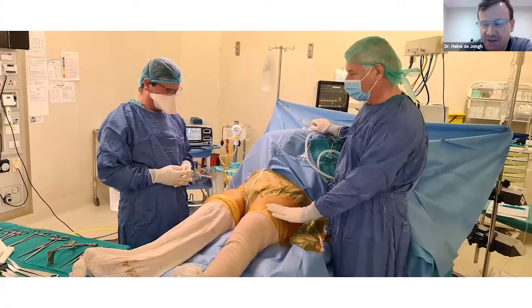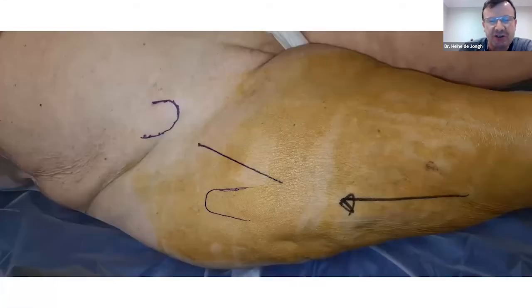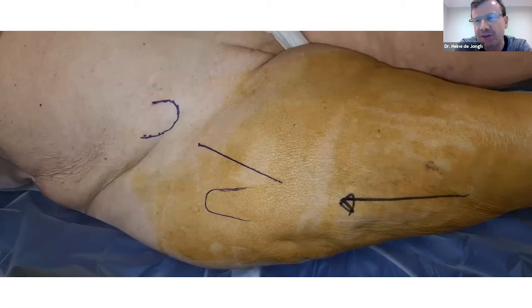As I said, one assistant is standing on the other side, and when I start with the femoral work, he comes to my side. The incision I'm not going to talk too much about. We obviously, like Johnny said from his experience, took it a bit more lateral to avoid the lateral cutaneous nerve. If I have time, I'll show you something about the bikini incision later on.